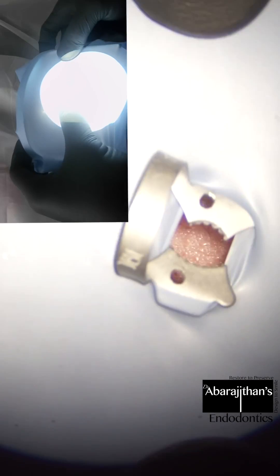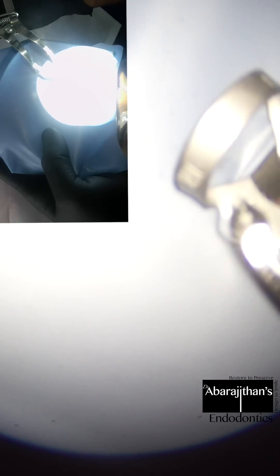Instead of using a template, the patient's face and the jaw along with the teeth is used as a template to mark where you need to punch the hole for perfect rubber dam orientation. And then a wing clamp is always better. So the wing clamp is now attached to the sheet over the wings of the clamp in this way. And following this, the steps are very simple.